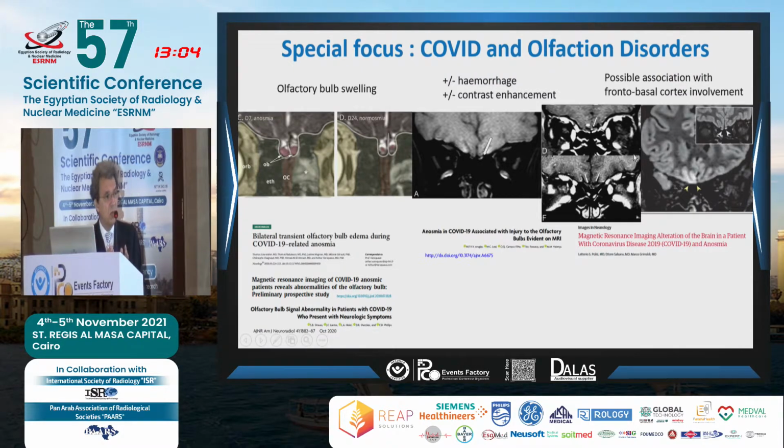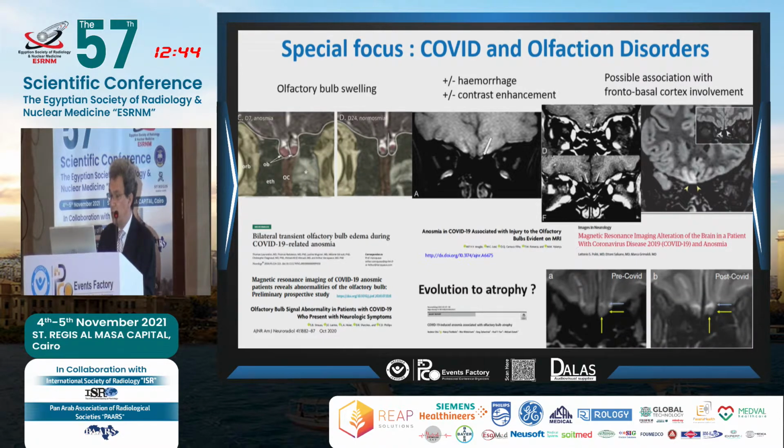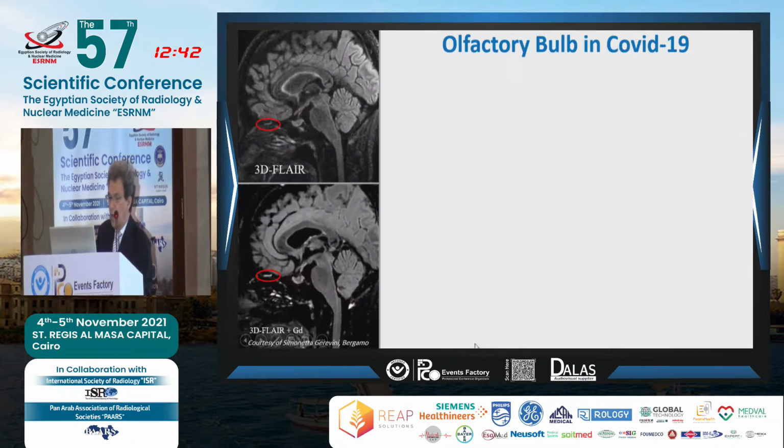But it may not only be focused on the olfactory bulb. You can also have changes in the frontoorbital region, as you see here. Now, we know that some patients recover and get back to normosmia, some don't, and some in between take a long time until they get normosmic again.